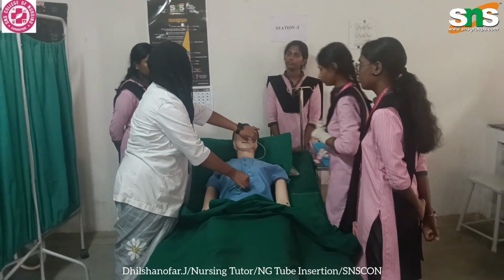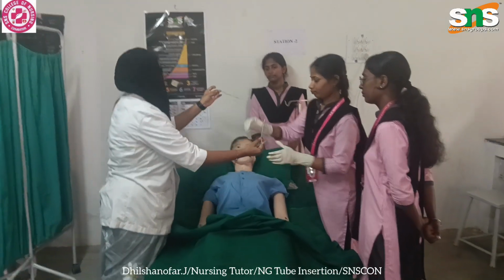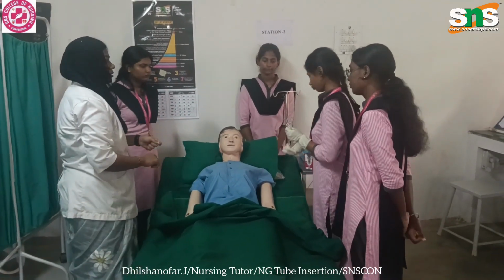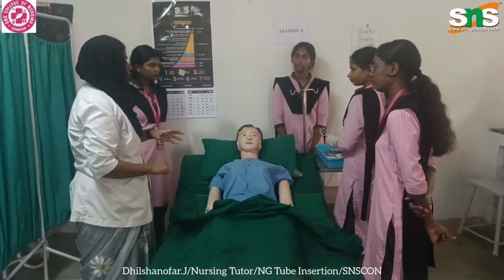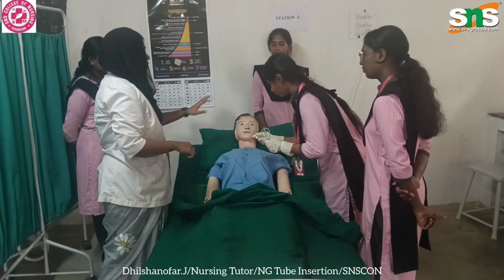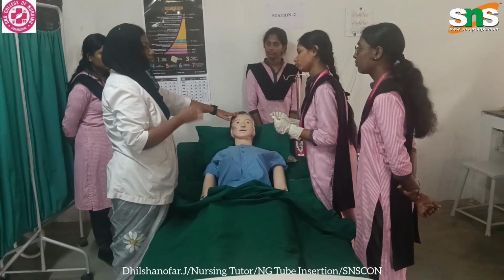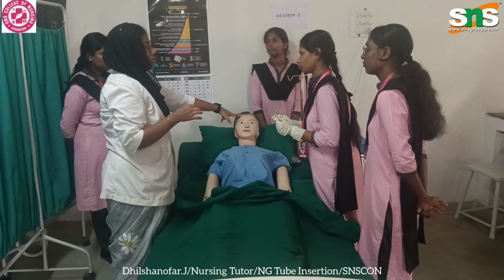So this is the measurement of our patient. Now you have to lubricate the NG tube for 1 to 2 inches. First thing, you have to instruct the patient. It will cause irritation to you, so you have to swallow.